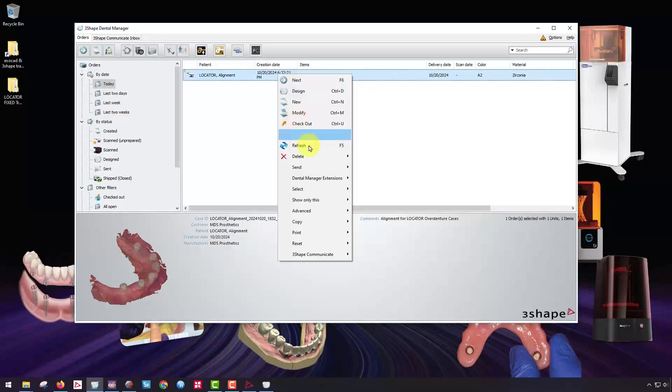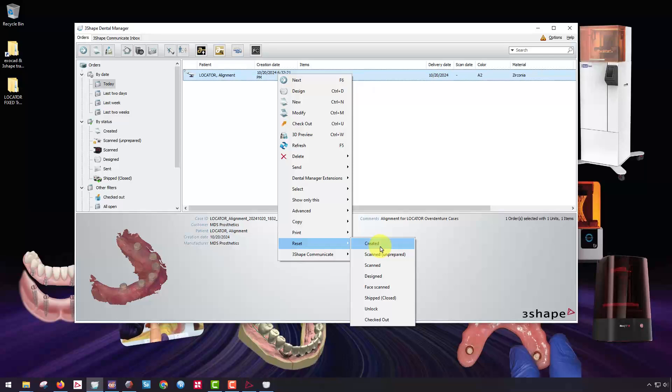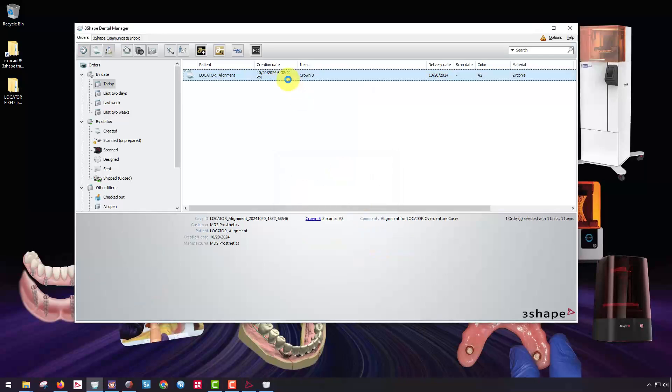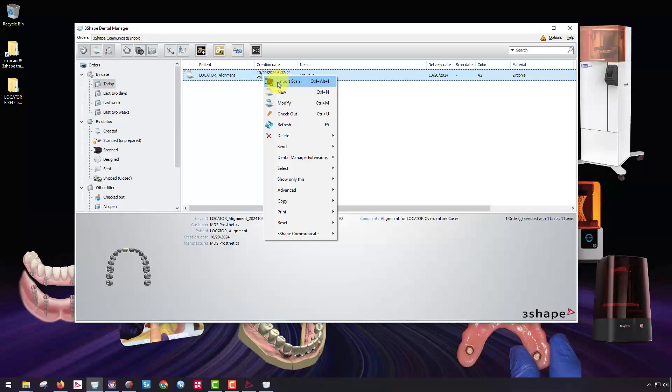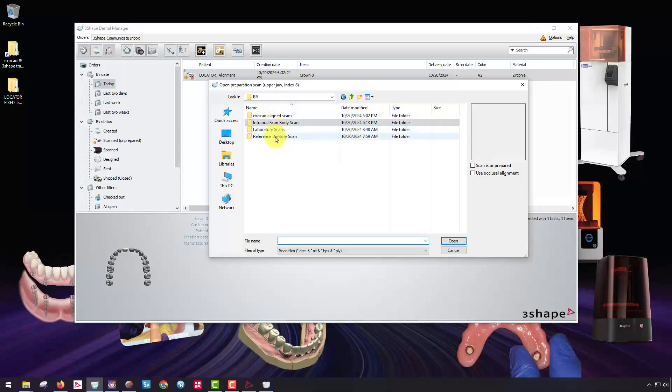Now I'm going to reset this because I already have my existing scan on here. I'm going to reset it to created, then right-click and import scan. It's important that I bring in the reference denture scan as the part I want to align something to. Anytime I'm doing this alignment function using the dummy patient, you want to import the reference denture scan first — the lower 360 scan, the opposing prosthesis, or whatever is in the opposing occlusion.